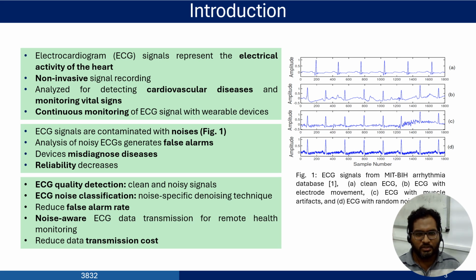So the analysis of these noisy signals generates false alarms, and the device misdiagnoses the disease, and the reliability of the device reduces. So, to improve the reliability of wearable cardiac health monitoring devices and to reduce false alarms, we need an ECG quality detection method, which can detect clean and noisy ECG signals and remove noisy ECG signals from further analysis.